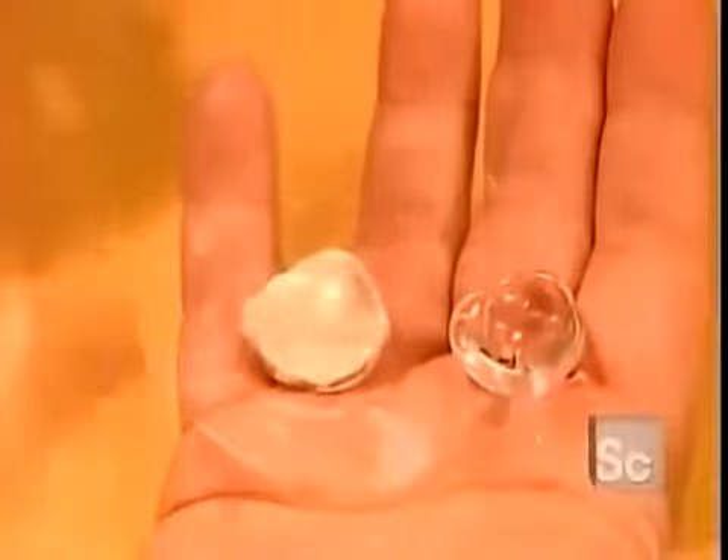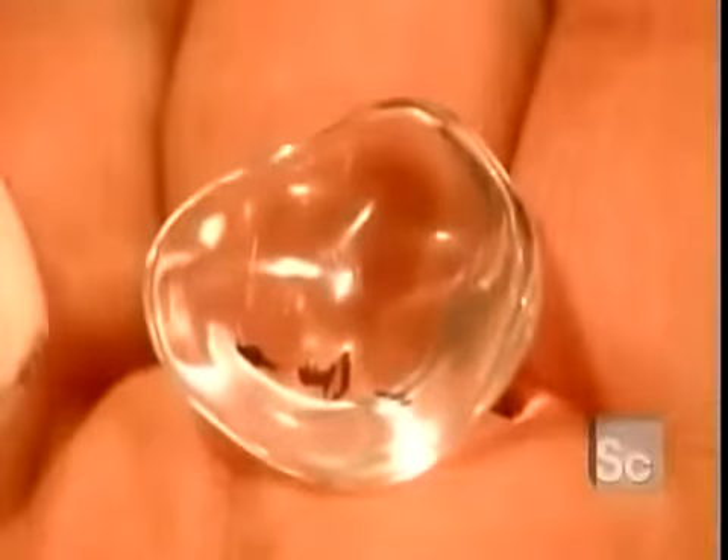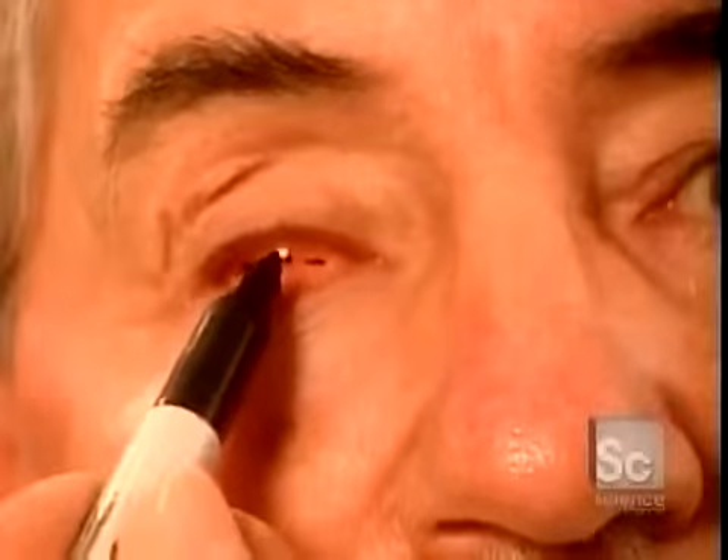Here's the original impression compared to the acrylic model they've just cast. This model is called the fitting shape because they use it to fit and mark the positioning of the fake iris.